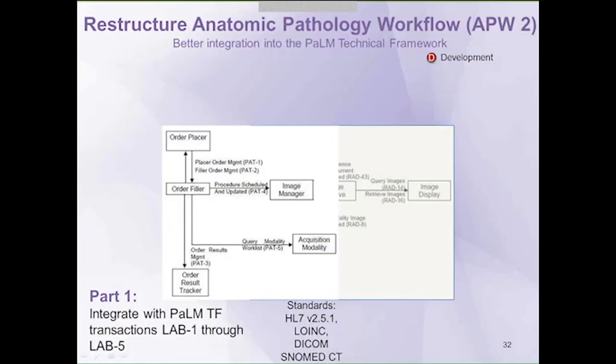Next slide. So I wanted to come back to the anatomic pathology workflow briefly to provide just a little bit of history, because there's a shift, as I mentioned, towards digital pathology and specifically being able to capture using what's called whole slide digital imaging or whole slide microscopy imaging in the anatomic pathology workflow.